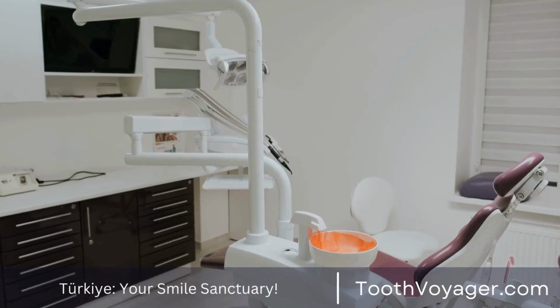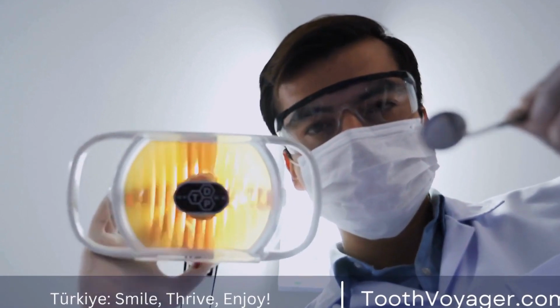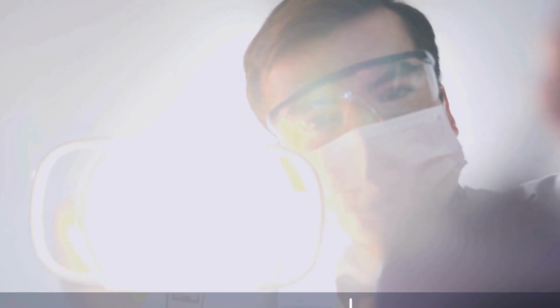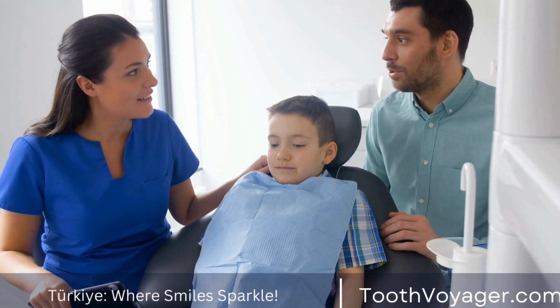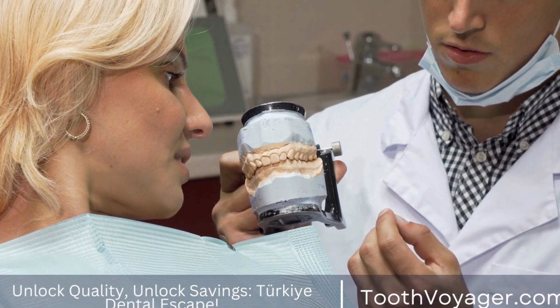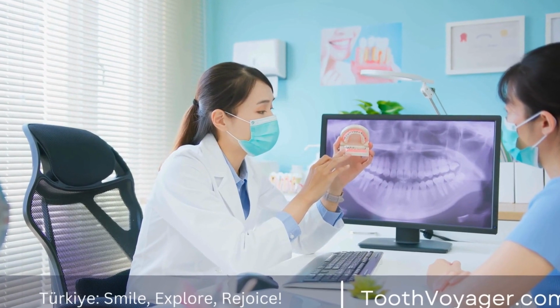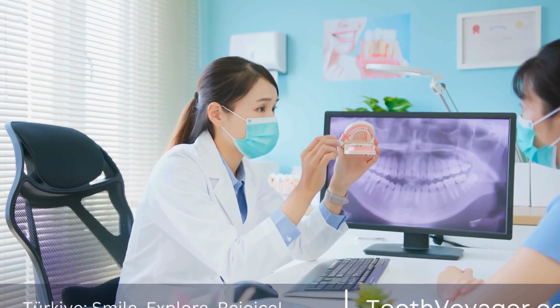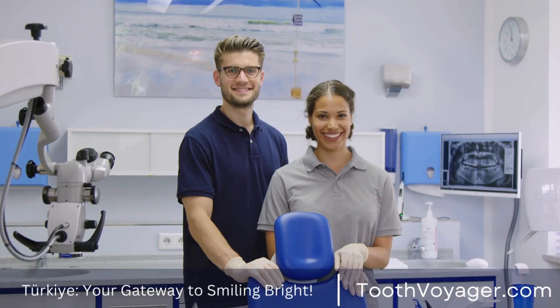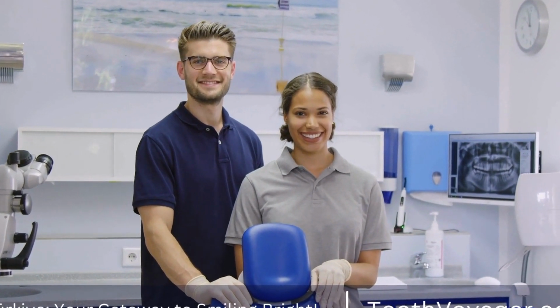4. Implant-supported dentures. Implant-supported dentures are a hybrid that offers the advantages of dental implants as well as traditional dentures. It involves attaching a pair of dentures to a number of implants. This provides greater security and strength for replacement dentures. Implant-supported dentures have better chewing capability, decrease the loss of bone, and improve aesthetics when compared with traditional dentures. They are the best choice for patients searching for a safer and more comfortable solution for replacing their teeth.